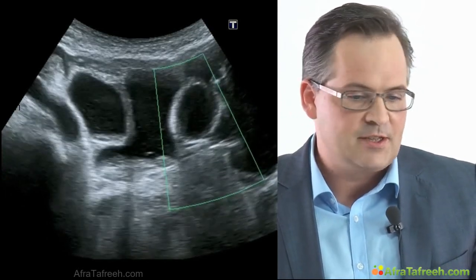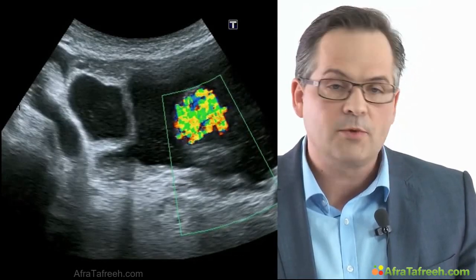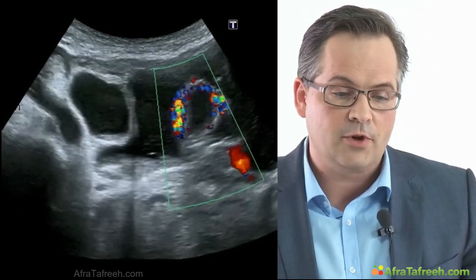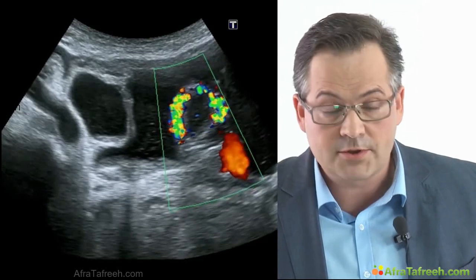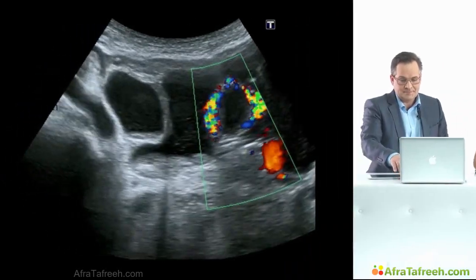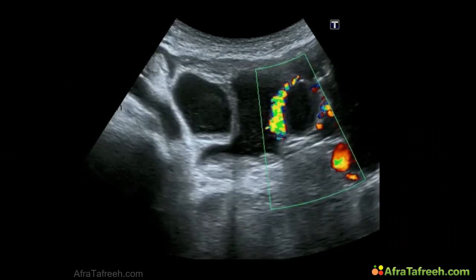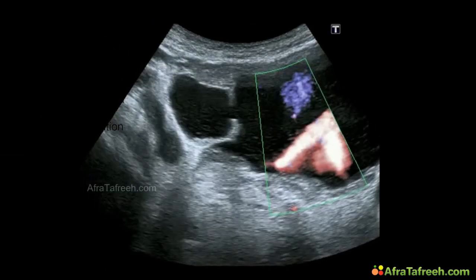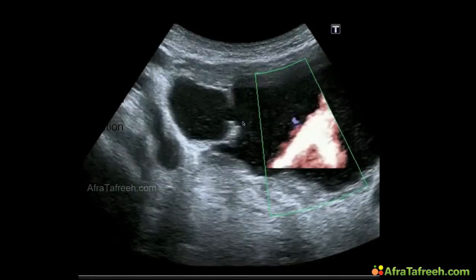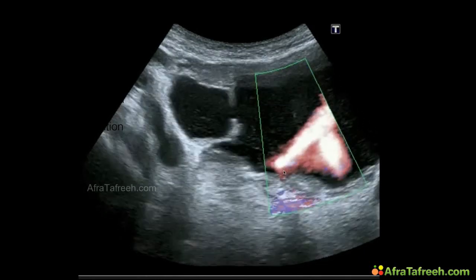Here we can see this blooming on this foreign body in the bladder. It's a phenomenon we can also use when we are looking for gallstones or stones in the urinary tract. You were somehow in a playful mood, weren't you? Yes, indeed. Once I got up, I wanted to make some nice clips. And so we also displayed the inflow of the urine into the bladder from over here and here. So we knew furosemide has done its work.